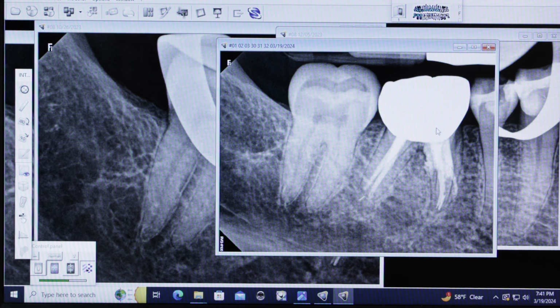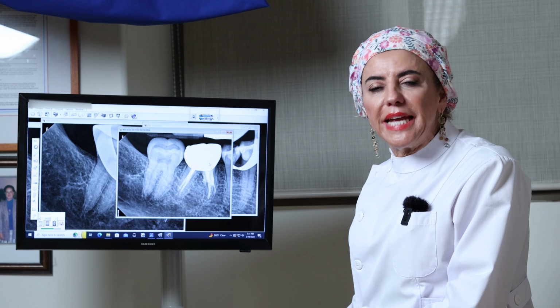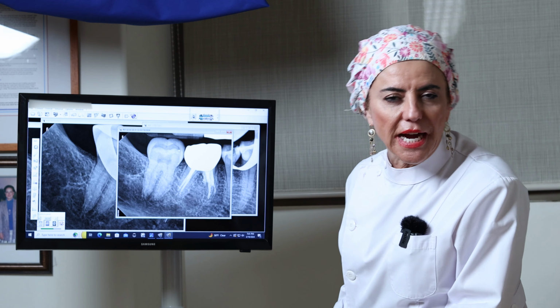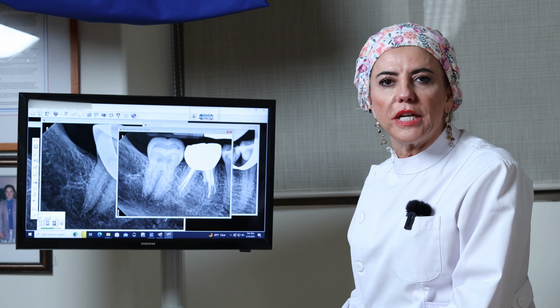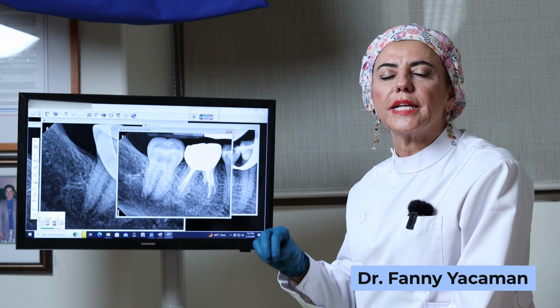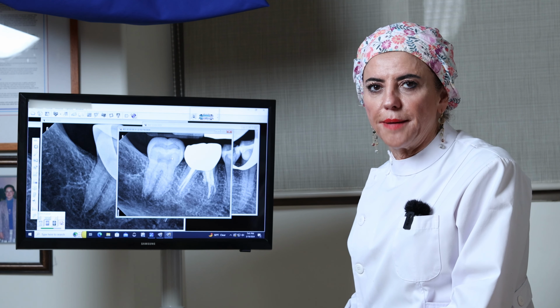We had the patient in a provisional crown for a couple of months. Luckily, when I did a retreatment on this patient, the pain disappeared. Now she's happy. We became friends. She invited us for dinner with her husband. We became very good friends, and I just want you to learn from today that when you have an instrument broken inside the canal, be sure that the instrument can be bypassed and the canal is irrigated to the maximum, so this tooth will survive.